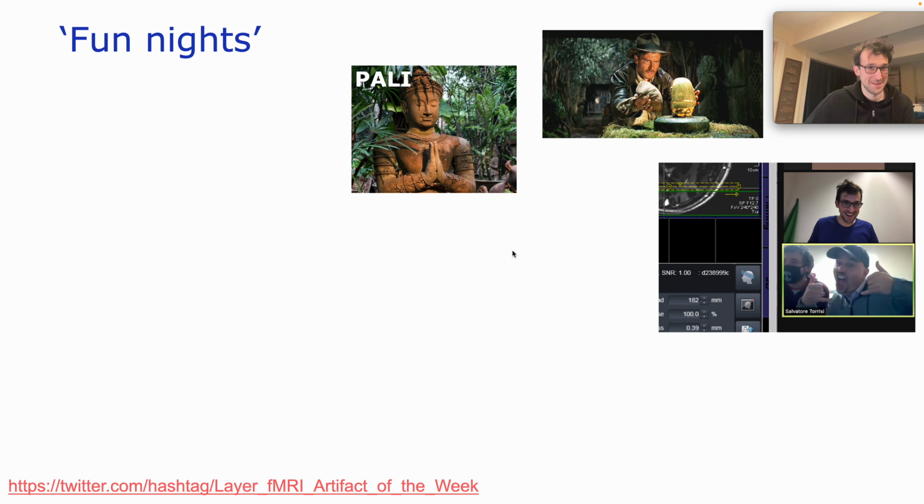We had our arch nemesis, the PALI, and I'm not referring to the Hindu gods of the Pali scripts, but rather the power absorption limiter, this kind of Syngo Siemens error that was coming from a weird interaction of using memory on the MaRS with these very many channels, but also the ICE pad reconstruction using memory that should be allocated to SAR. I don't know. They at the end ended up, I think, changing the infrastructure and architecture there completely. And it took maybe 4 weeks of unsuccessful scans because the scanner would just stop randomly.